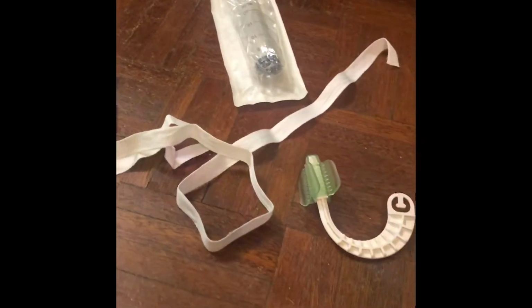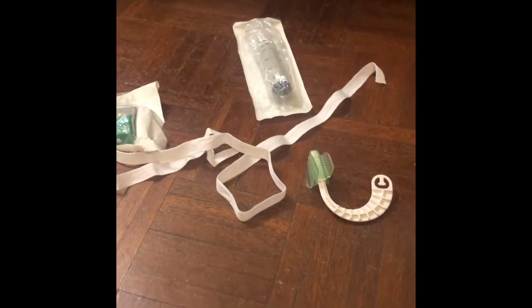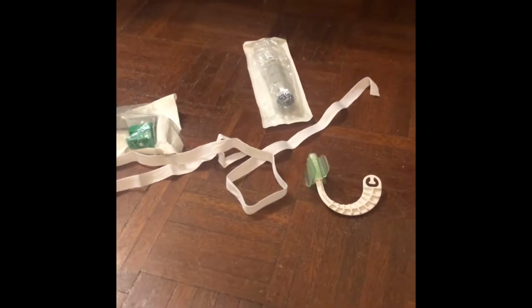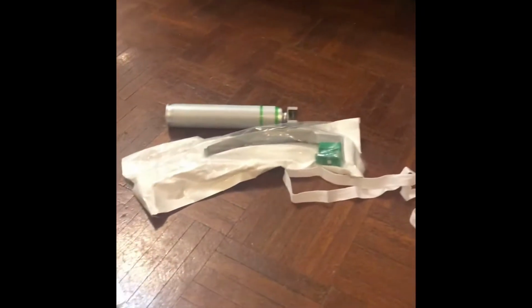We're going to have some tape to tie in the airway, the bite block. We're going to have a syringe to inflate the cuff. We'll check that the cuff can be inflated, and lube for the cuff to pass through the vocal folds easily. With the syringe, we're going to inflate with 5 to 7 mils of air. We don't want to go any more than that because we might cause some mucosal ischemia and rebound edema with extubation.